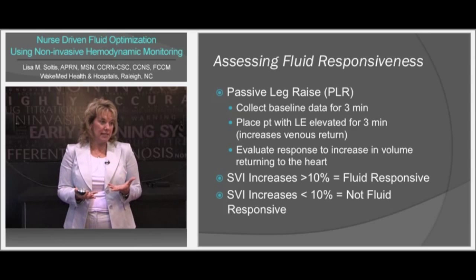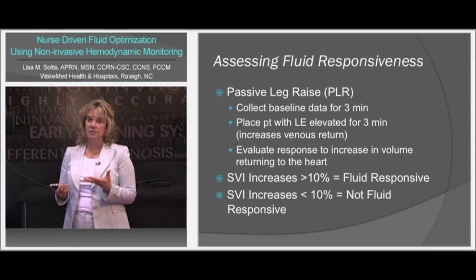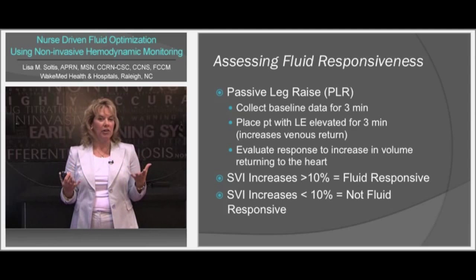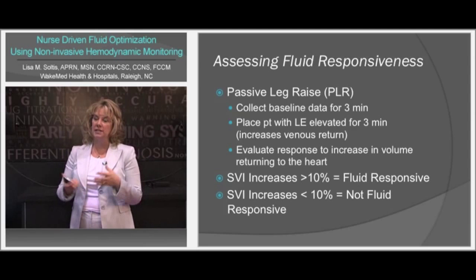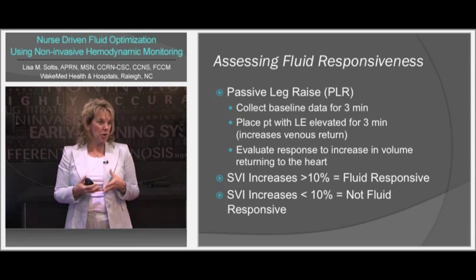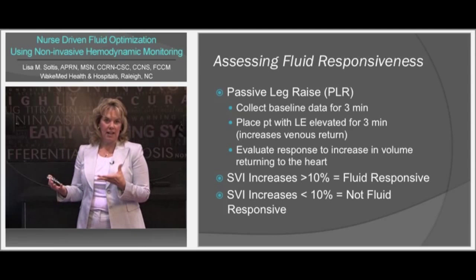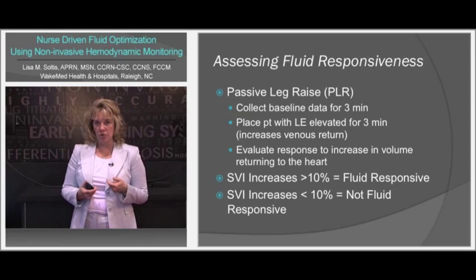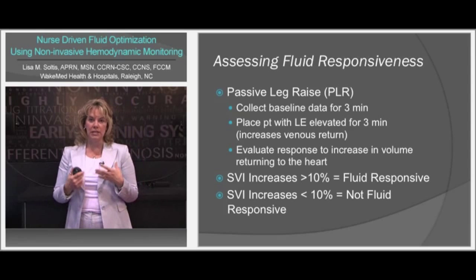So a passive leg raise, when we lay our patient down and raise their legs, gives about a 200 to 300 ml fluid bolus with an increase in venous return back to the heart. Then this technology, the NICOM, is able to measure what the heart does with that extra volume, and that can help us predict how fluid responsive they are.